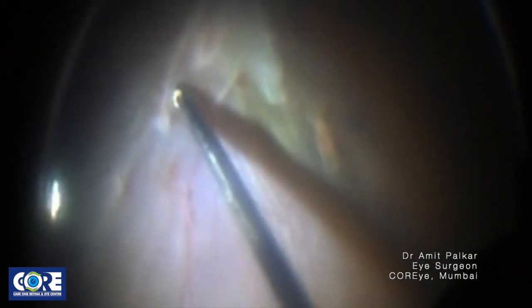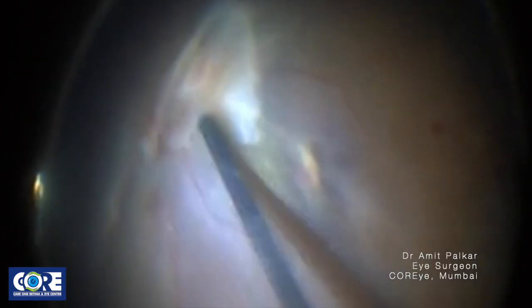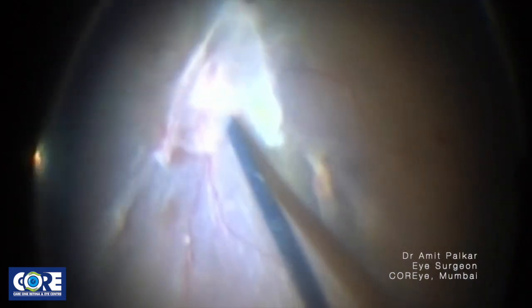The membrane appears to be a flat one. Usually there is a clear plane between the membrane and the retina with multiple point attachments or flat attachments, and these attachments are pulled up to cause traction to the retina.